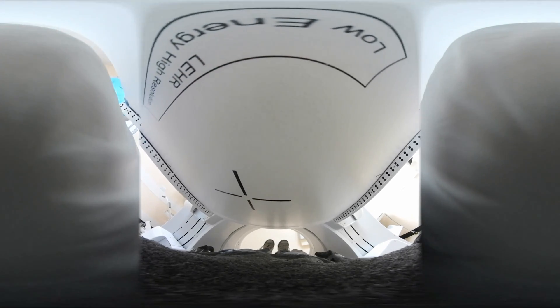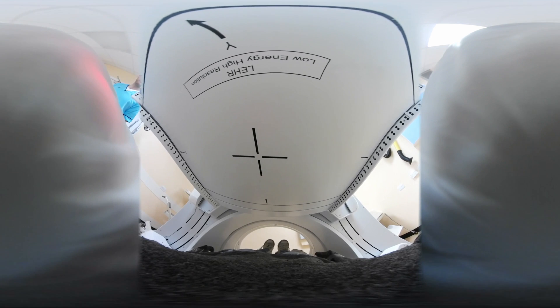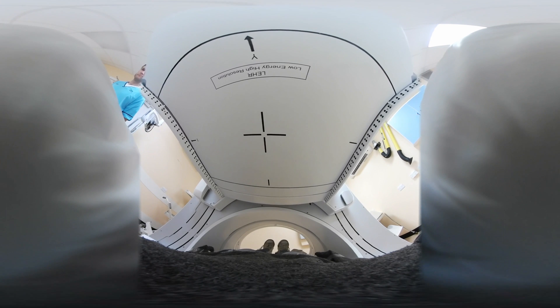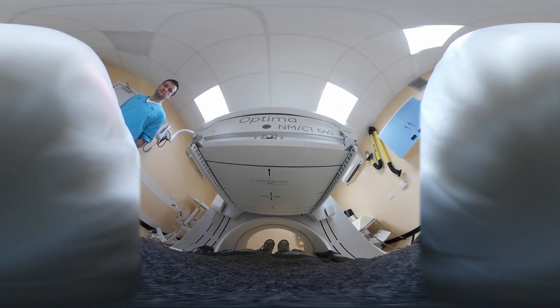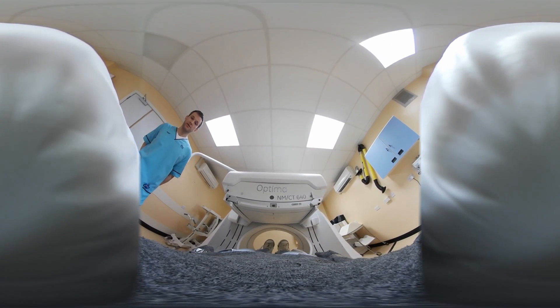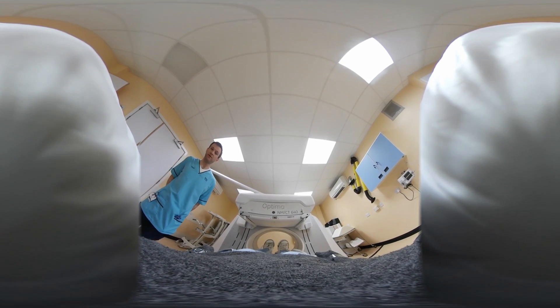Okay, we'll stop the scan here. Very well done. We can move the guard to the camera now, and then move the table down so that you can get off and head back to the waiting room.